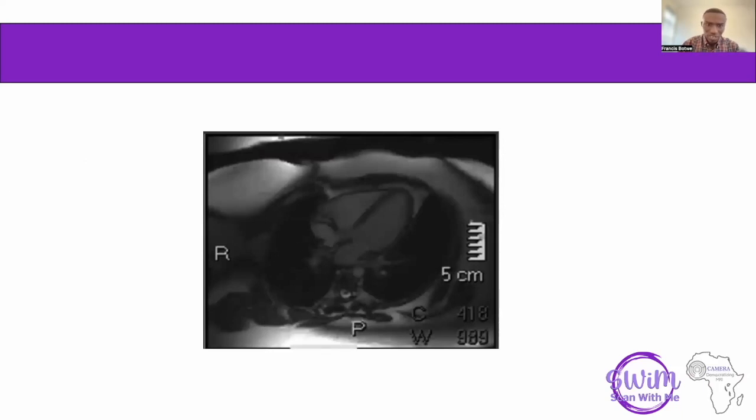All right, so this is the video of the cine imaging, which shows the movement of the myocardium. Wish I could play that.